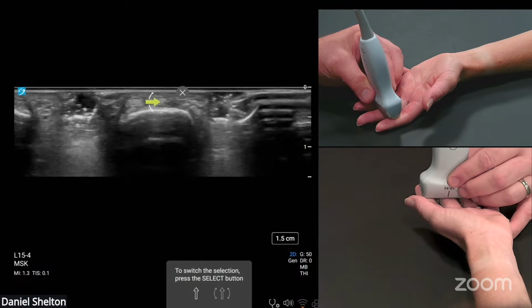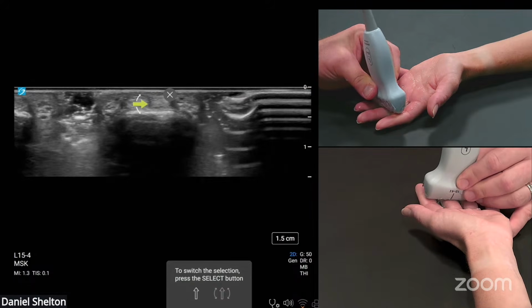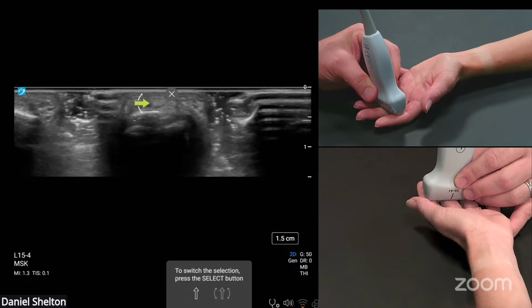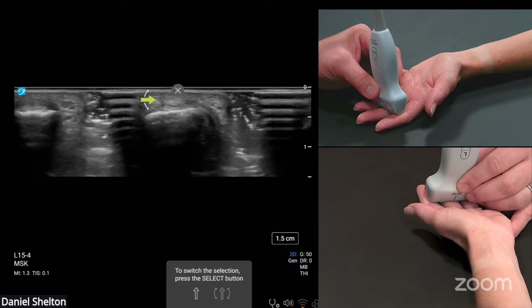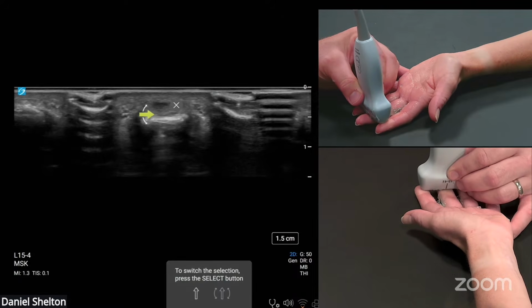And we see up top what looks like three tendons. But what we really have is superficialis, superficialis, and profundus. What's not commonly on a lot of anatomy diagrams is that there are two heads to the profundus. You will see it on most of the surgical stuff, but not just general drawings. But there's a septum right there, and it stays there all the way to the enthesis.